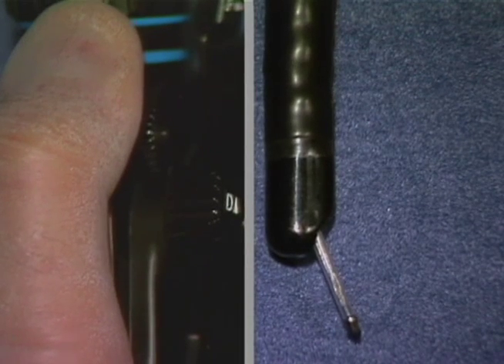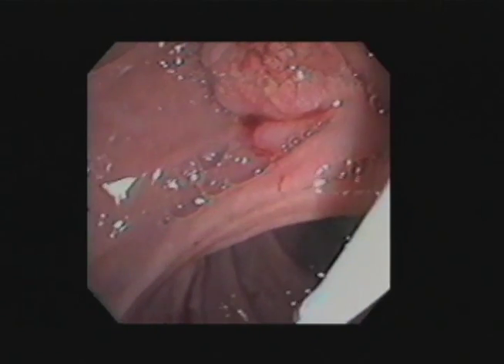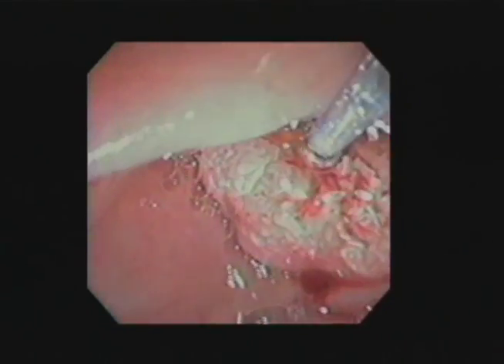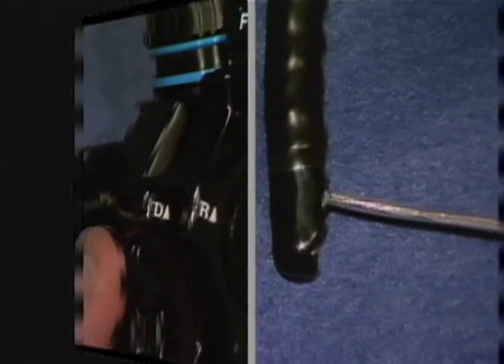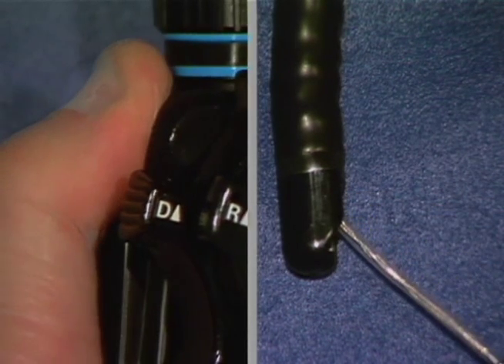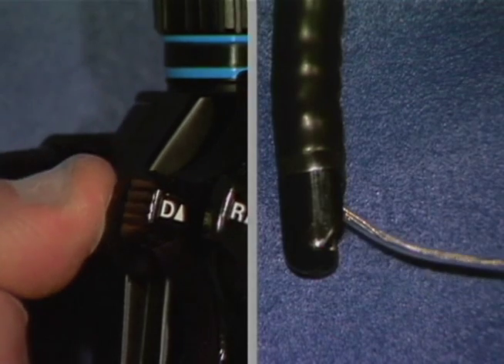Carefully protrude the Teflon sheath out of the endoscope approximately 3 cm. Raise the forceps elevator to bring the basket tip into view, then further advance the Teflon sheath carefully. While observing the duodenal papilla through the endoscope, insert the Teflon sheath tip through the papilla into the bile duct by operating the endoscope's angle controls and the forceps elevator. If abnormal resistance is encountered, lower the forceps elevator, advance the Teflon sheath a little, and then operate the forceps elevator again.